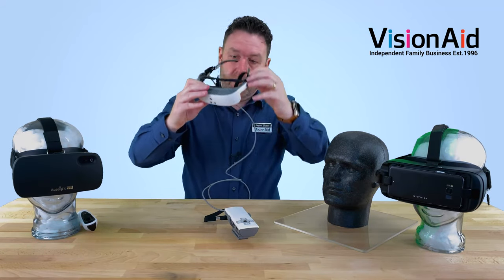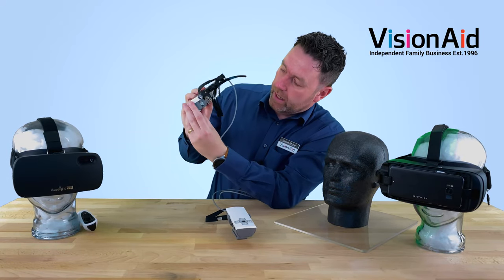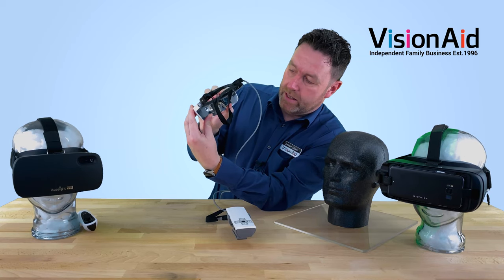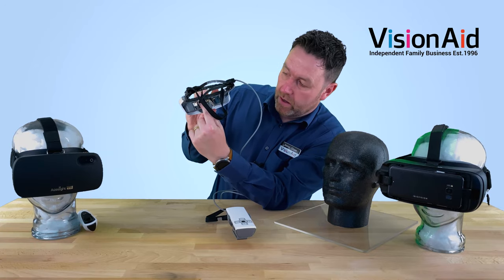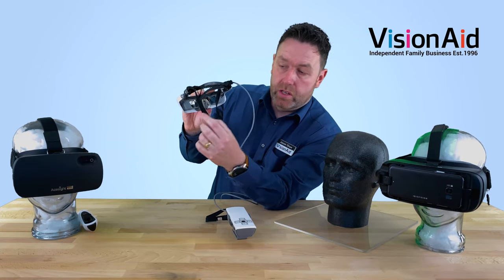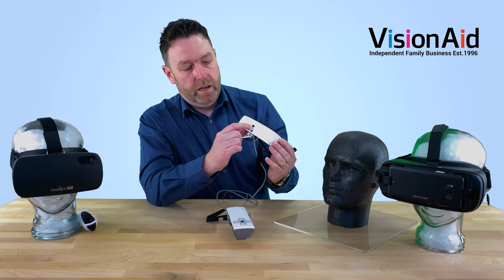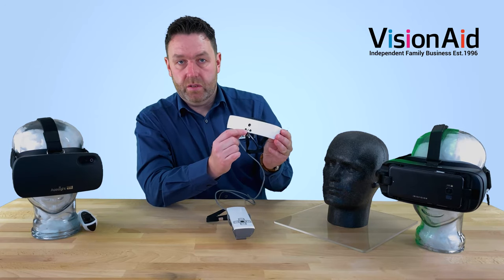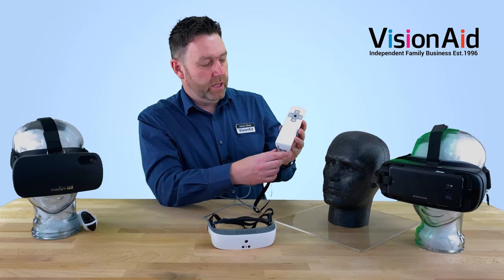This is a bespoke headset — much smaller than the others. It's got two OLED screens inside. We can adjust the distance between the pupils, normally set for the individual. You can also have your own prescription lenses built into this one as well, so you don't have to wear glasses under it. It's got a camera, an LED light, and two sensors, and it's auto-focus as well.